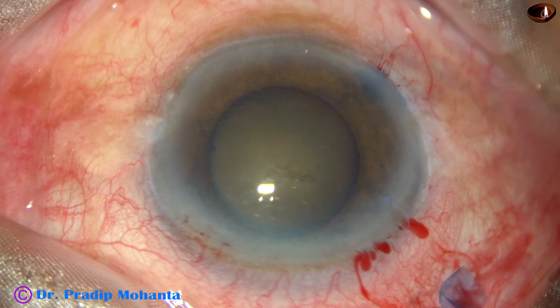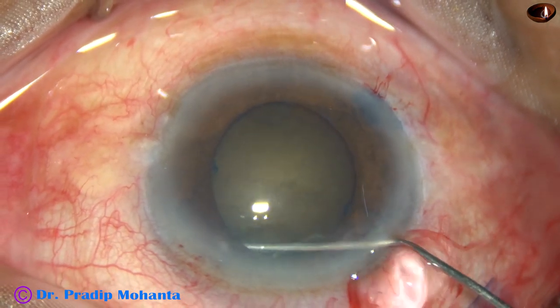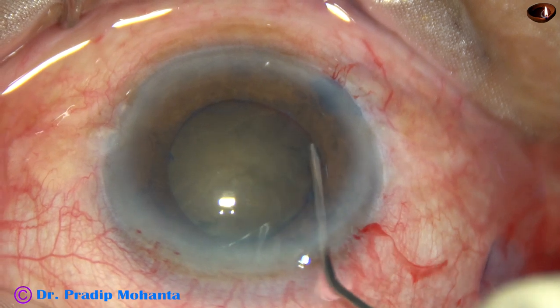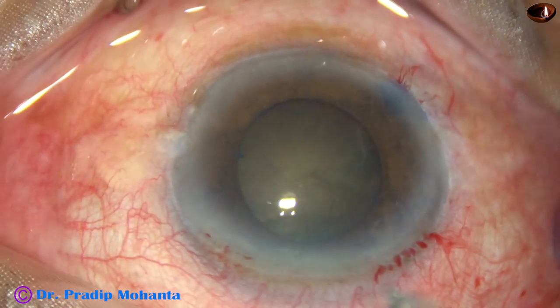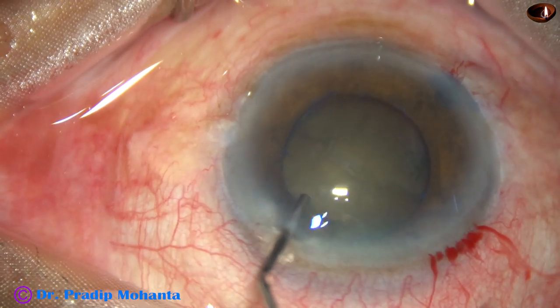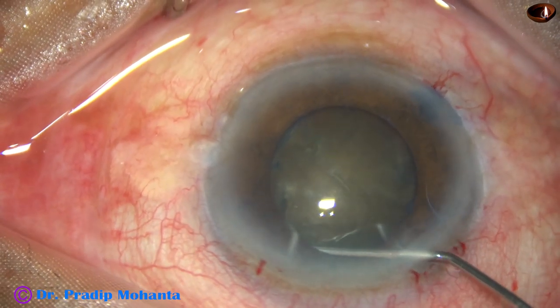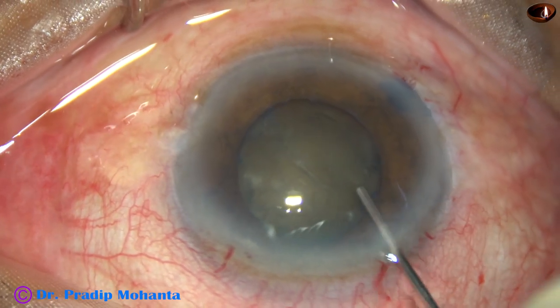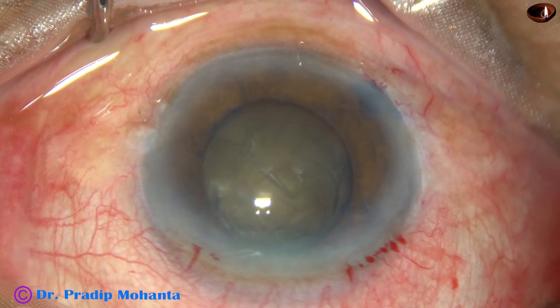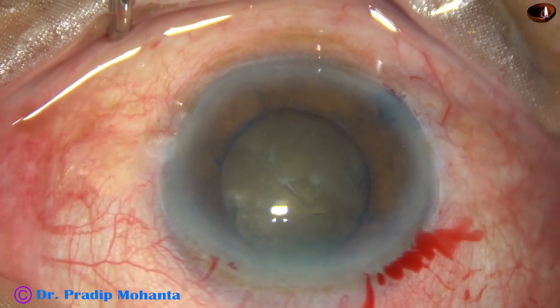Now hydrodissection is to be done. BSS is passed just under the anterior capsular rim, and we could see that the fluid wave went towards the opposite equator. Some more fluid is injected under the anterior capsular rim at 7 o'clock. The nucleus is depressed. Now an attempt is made to rotate the nucleus, but the nucleus did not rotate, probably because of weak zonule and maybe there are some firm capsulo-cortical adhesions in several places.